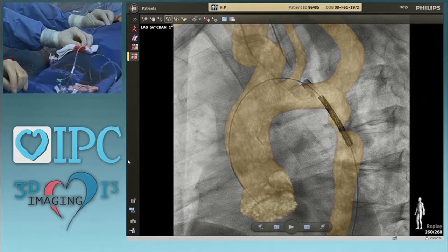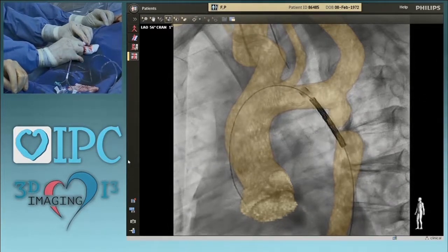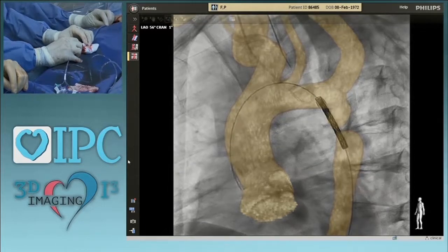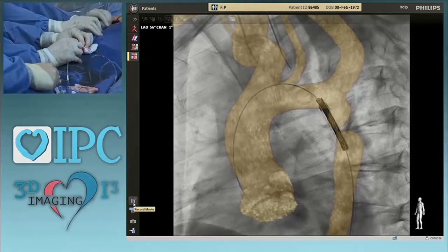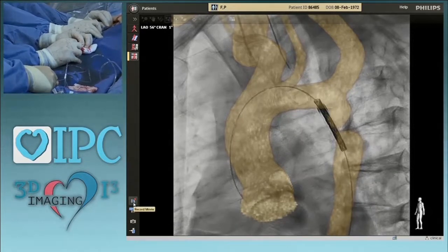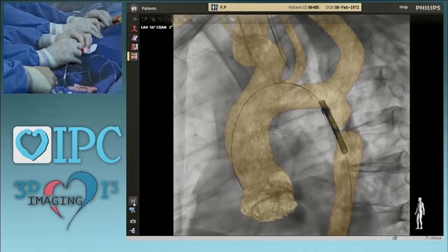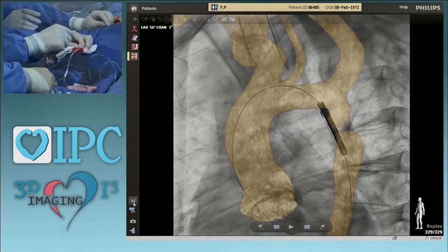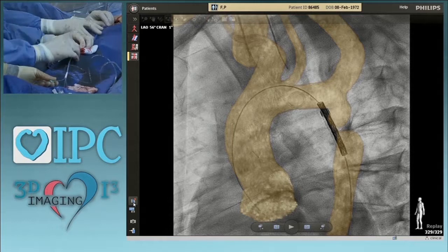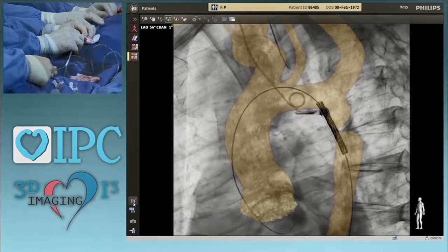He's coming right now. If you use a 12 millimeter balloon only, you can actually mount a covered CP stent onto a 12 millimeter Crystal and get it through a 10 or 11 French sheath rather than having to use a 14 French sheath. Yeah, I guess the other thing I would comment, we can mount it on a 12 BIB and do the same thing. Yep, but I think even pre-mounted, it will go through a 12 anyway. Yes, correct. Yeah, it's hard to get through a 10 with that because it damages, but yeah, the 11 or 12.